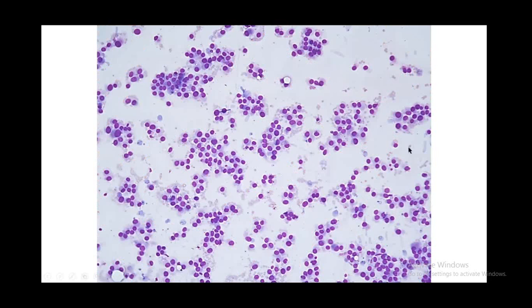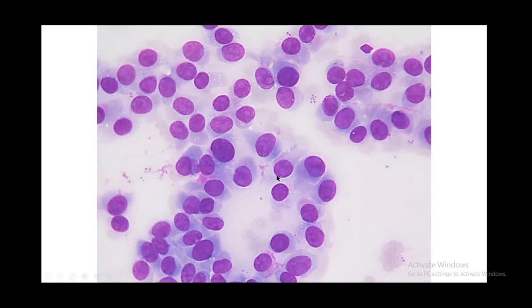Again, the Giemsa smears also showed these very cellular smears, with plasmacytoid cells, eccentrically placed nuclei, rounded nuclei, and oncocytic appearing cytoplasm. The higher magnification shows these plasmacytoid cells with rounded, eccentrically placed nuclei with intranuclear inclusions and inclusion-like macronucleoli. No grooves were identified. The cytoplasm was pale to oncocytic and did show very fine vacuolations.